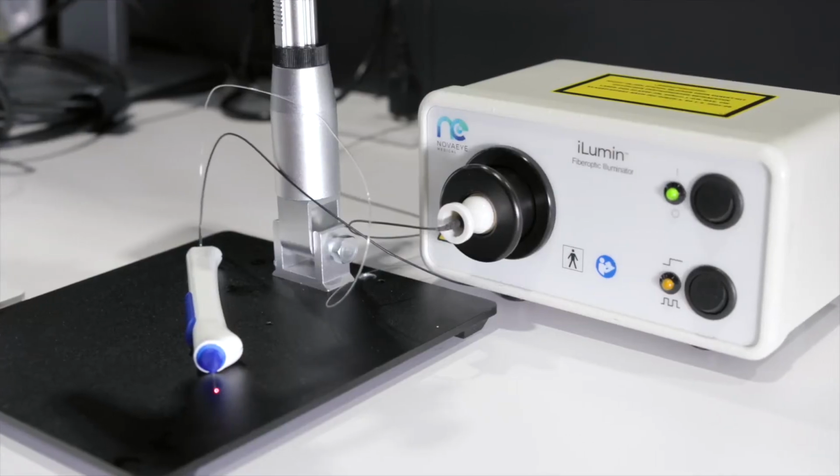It'll do a complete 360. It'll be under high pressure, high volumes of viscoelastic, and do a complete 360 circumferential with one slide of a slider. And as you pull it back, you'll viscodilate through the collector channels, trabecular meshwork, and Schlemm's canal.